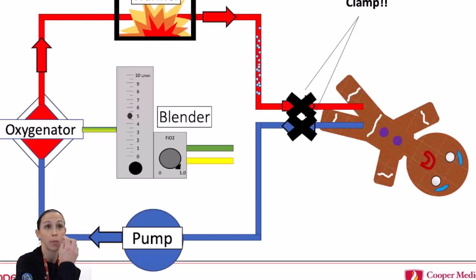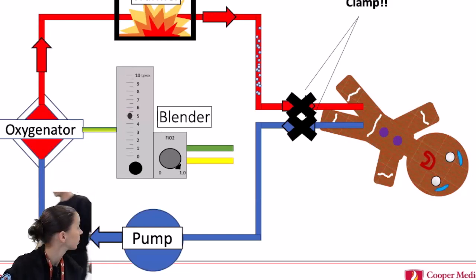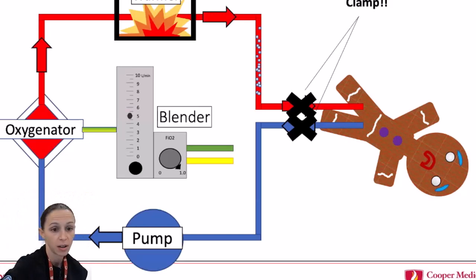Even if it's a small port, you're going to have a significant amount of blood loss. Or at least it's under positive pressure. Awesome. So I think the takeaways here are, absolutely VA ECMO, this is catastrophic air on the return side. Large amounts of air on the venous side or on VV ECMO are also catastrophic. So probably don't waste time aspirating. You need to clamp off and most likely do a circuit change.